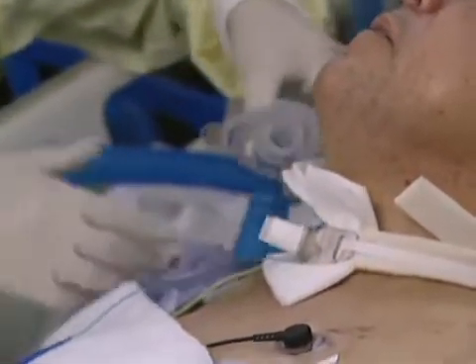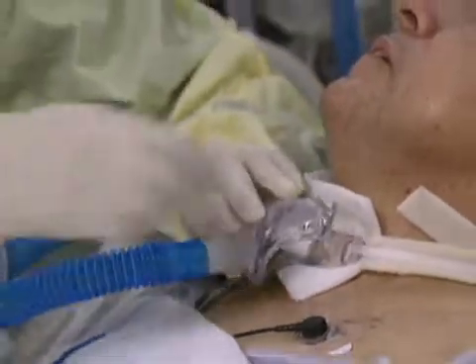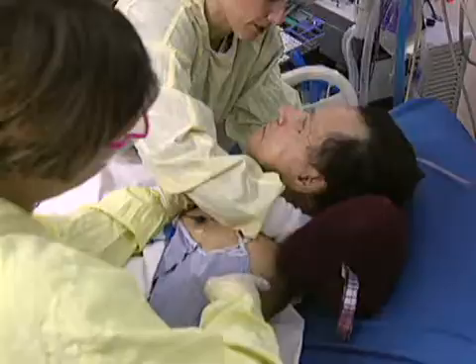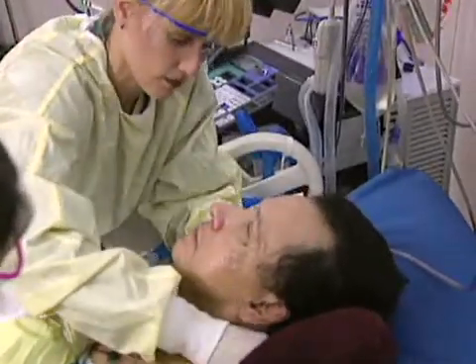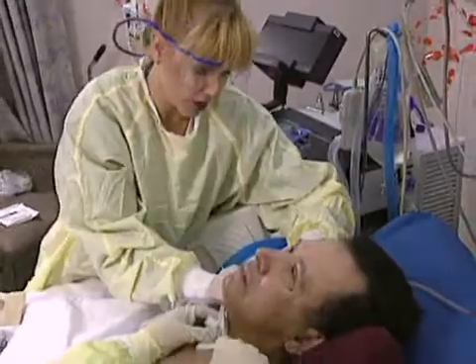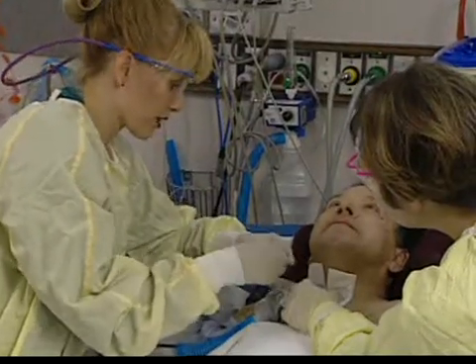Okay, we're ready to change your trach ties. So, Mr. Gonzalez, I'm going to reach behind your neck. The ties that keep the tracheostomy tube in place become soiled. Always have someone stabilize the tracheostomy tube as you apply new ties.